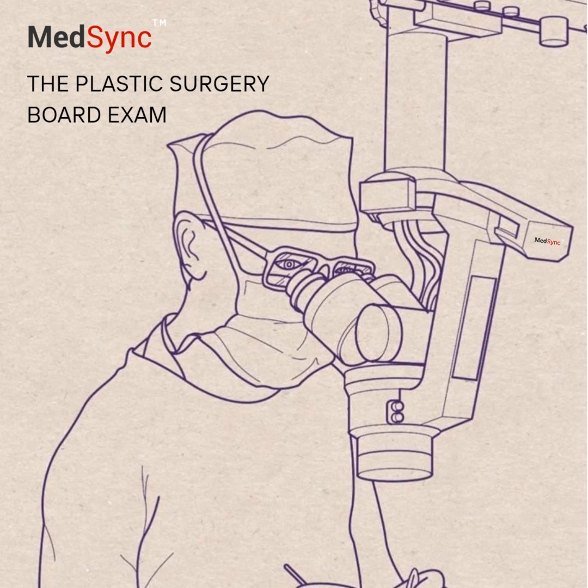Good. Dressing change frequency. Standard for a non-infected wound is usually at least 3 times a week, say Monday, Wednesday, Friday. And if it's infected? More often. Daily, sometimes even more frequently initially, often guided by the amount of exudate and clinical appearance, requires close monitoring. Can that frequency decrease? Yes. Once a wound is looking clean, granulating well, stable, you might transition to maybe twice weekly changes.